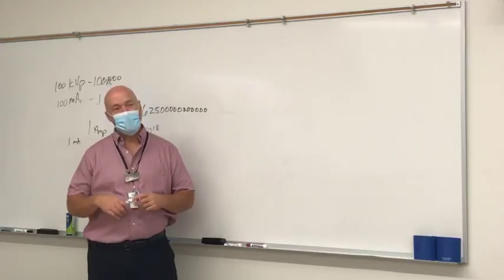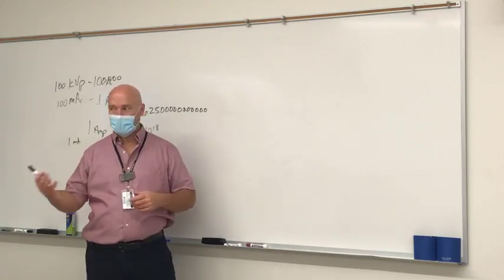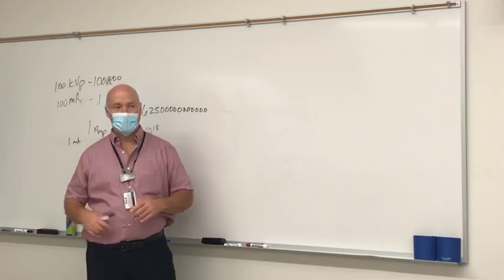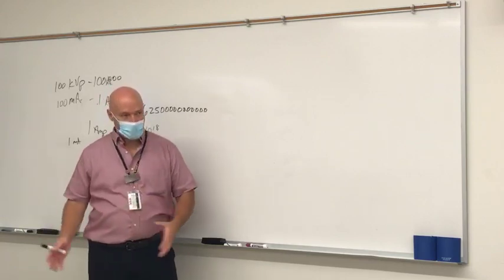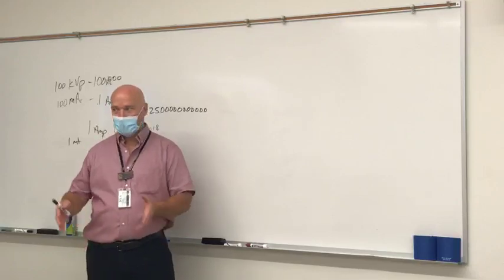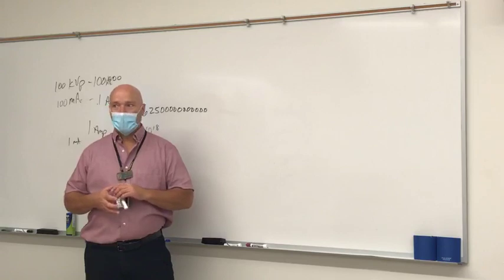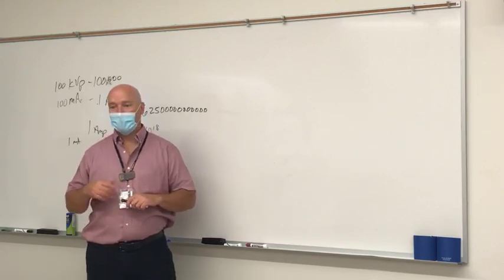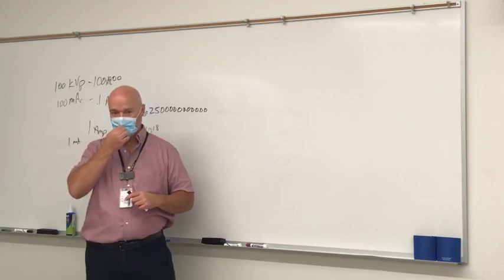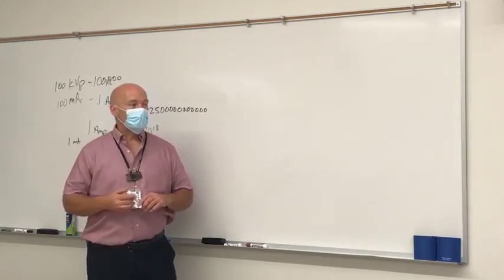So your KVP, you want to start taking mental note of what kind of KVP you're using, but inasmuch as getting your checkoffs, we want you to focus on positioning. And after you get that down, then we want you to start learning technique. Probably the most common feedback that we get from people who graduate from the program is that they didn't feel that they really understood technique enough.